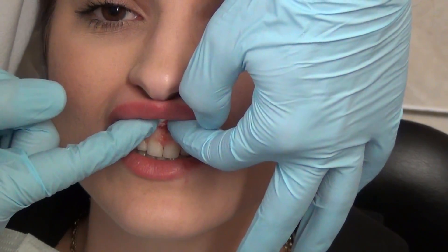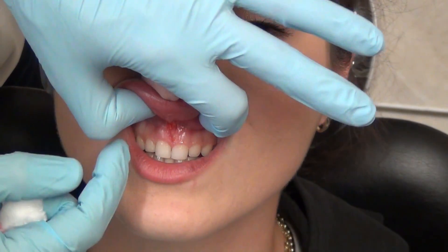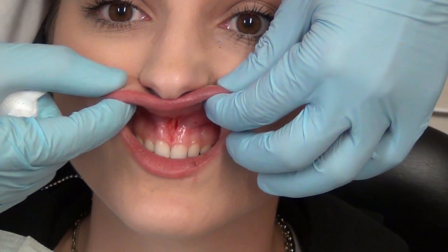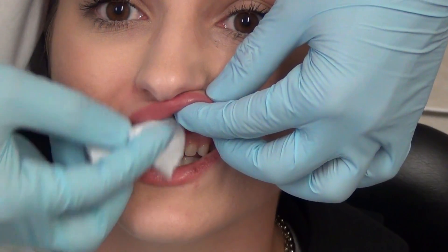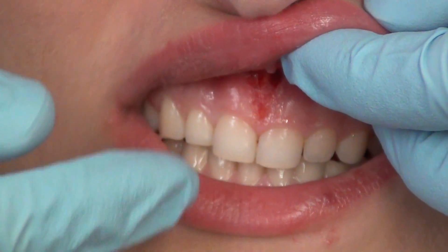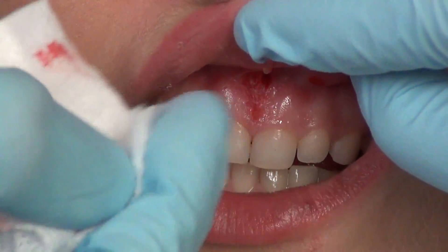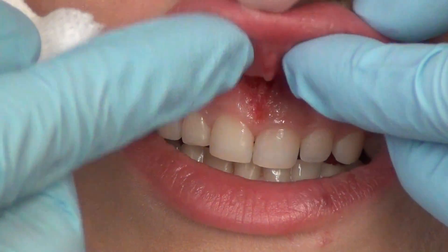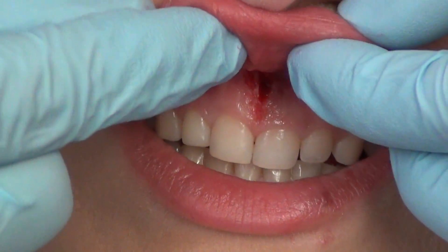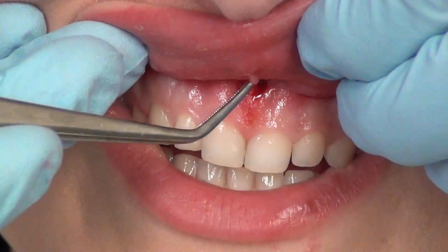I can't feel anything. See, where is it? It's completely gone. Let's zoom in. See, now where is it? Nowhere. At the top — see the tip here? That's the piece which was attached right there.